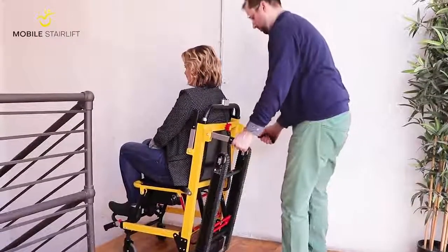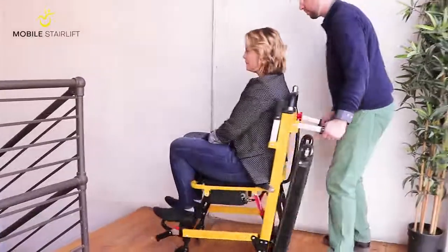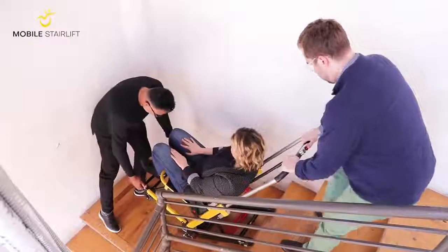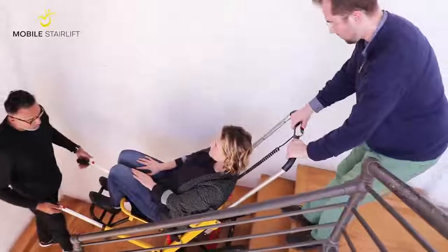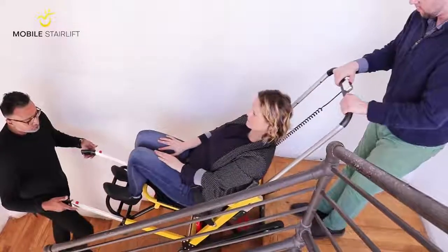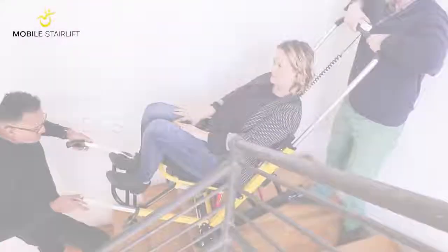Then fold out the two handles on the back of the seat, unlock the back wheels, and wheel the chair away. While it is possible for one person to easily operate the stair lift, it is our strong recommendation to have a second operator stand below the stair lift and act as a safety spotter and emergency backup. The handles on either side of the footrest can be extended for the second operator's use.